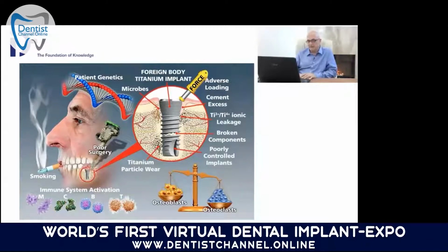Looking at the scientific literature, we are getting a little confused because we are being told that there are various reasons for periimplantitis. There's a lot of research done on this. This research is done on periimplantitis for many years, 20 years. I mean, since these rough surfaces appeared on the market, maybe even 25 years. But science has not found any solution. And the only solution that would work, of course, everybody knows this, is to use polished implants. But this is against the marketing strategy of the big implant manufacturers, so it's probably not going to happen.